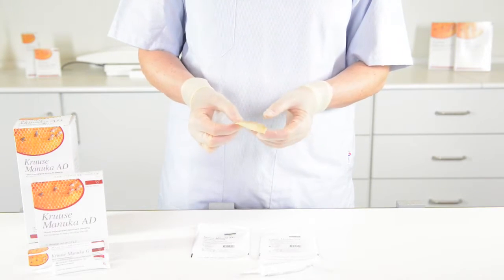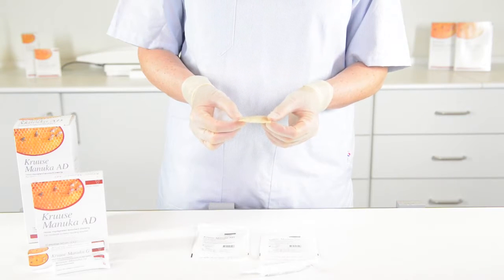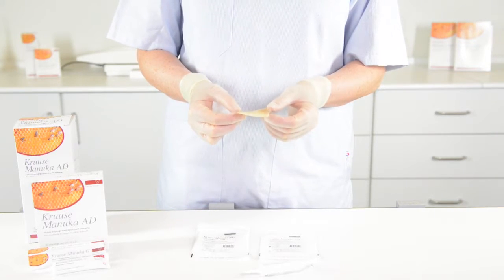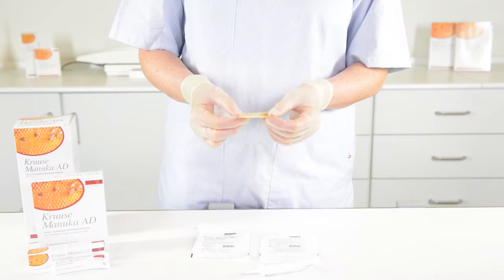This product you put directly onto the wound. As you would use it in a wound which is in the inflammation phase, it will create some excessive exudate, so you will need to cover it with a secondary dressing.